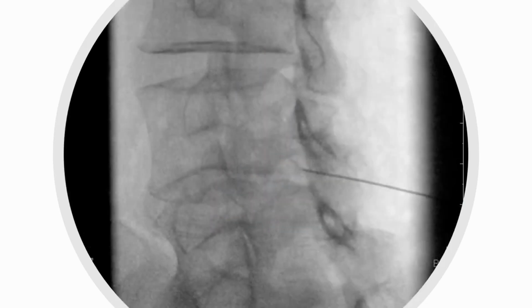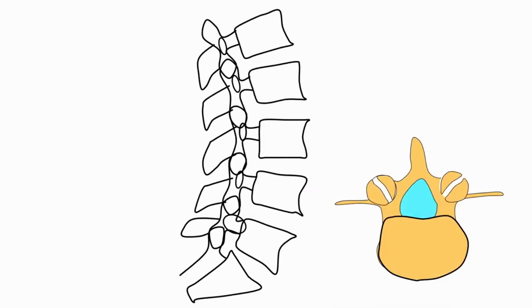Similarly, if the approach is from the right side, a left oblique image is used. The red circles again mark the profile of the cut section of the laminae, and the green line connects the internal aspects of the neighboring laminae. In addition to providing a faster and clearer image, the contralateral oblique image offers another advantage: consistency.